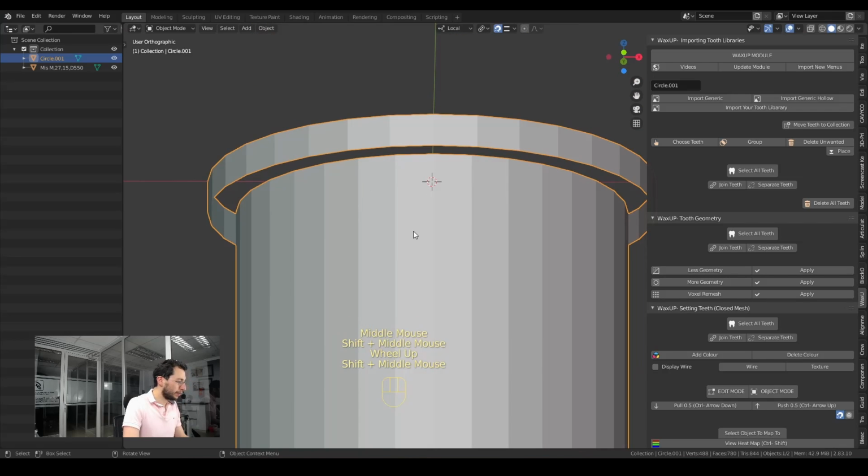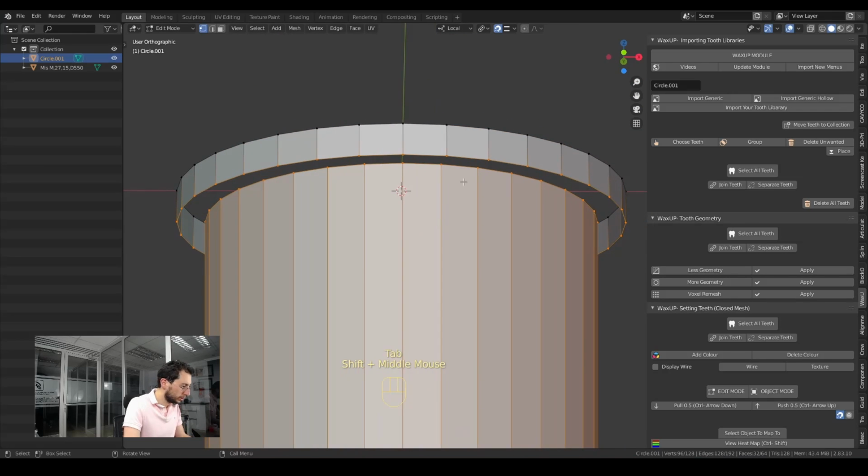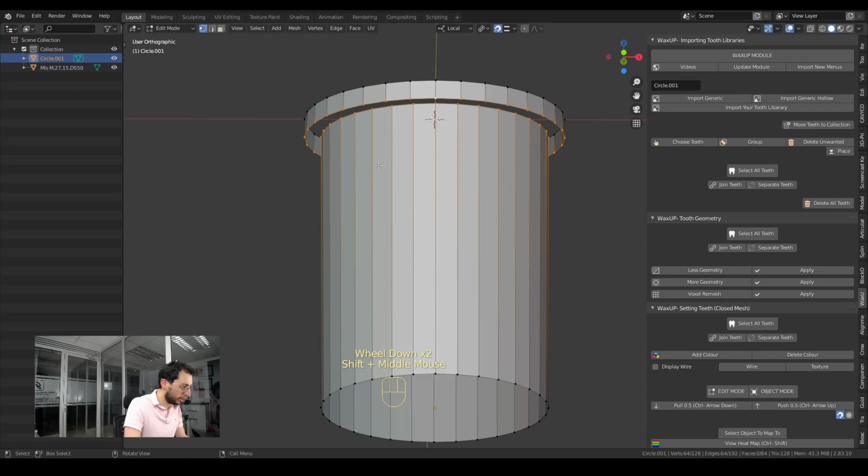Now that I have a single object, I can press Tab to go into edit mode, then Alt and click to select this circle, which is called a loop in Blender. And the same thing, Shift and L, Alt and click to select this other loop. So now I have selected only those two circles.